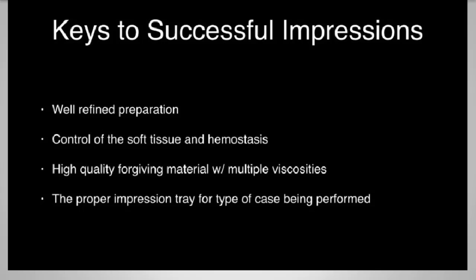In my opinion, there are 4 keys to capturing high-quality final impressions. We'll cover each of these in the duration of this webinar. The first is we need really well-refined preparations. The second is to control the soft tissue and hemostasis. The third is to use high-quality, forgiving impression materials with the right viscosity depending on the task at hand. So one viscosity may not fit across the board.